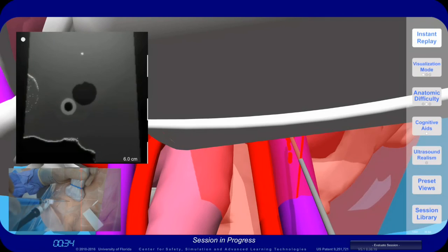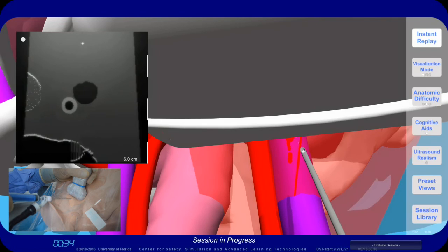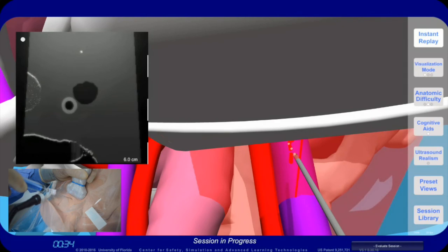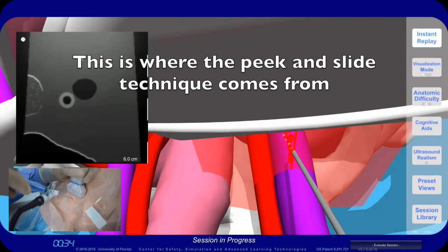To fix this, you want to pull the needle back to where it is out of view and then realign the needle tip with the ultrasound beam. Now we are looking at the needle tip. This is where the peek and slide technique comes from.